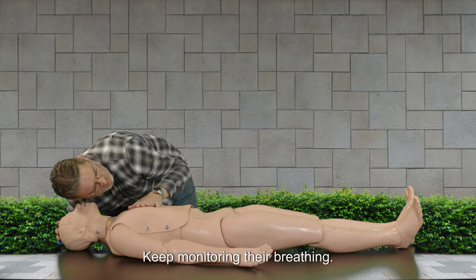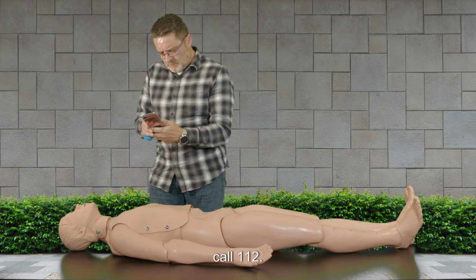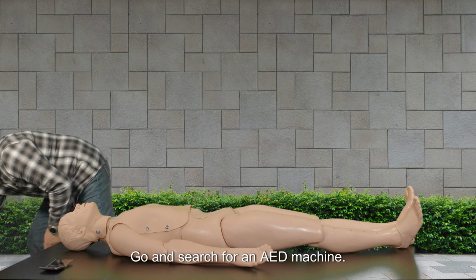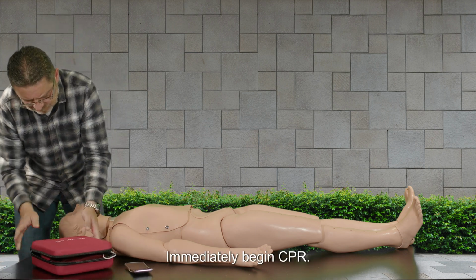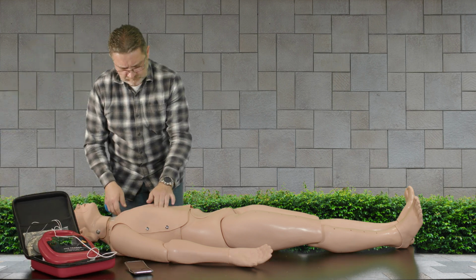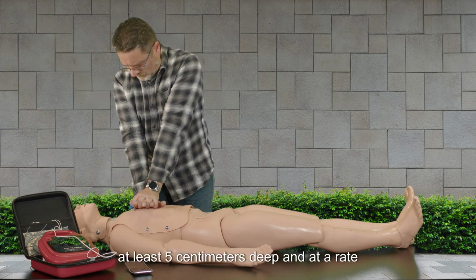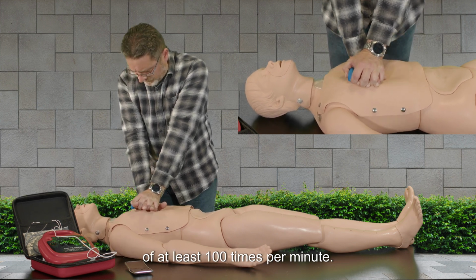Keep monitoring their breathing. If they are gasping or not breathing, call 112. Go and search for an AED machine. Immediately begin CPR. Place your hands in the center of the chest. Push hard and fast, at least 5 centimeters deep and at a rate of at least 100 times per minute.